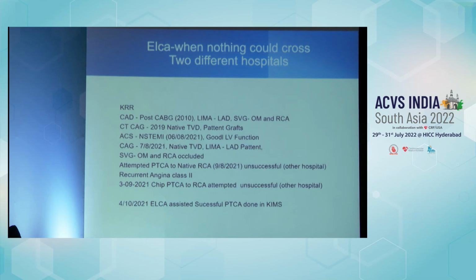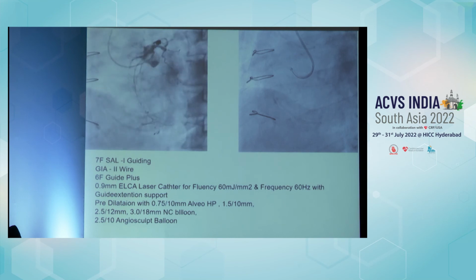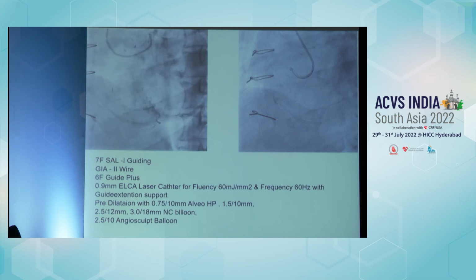The second time, the fluoro time was very high, and the procedure was abandoned. And then he came to our hospital, and this is his native coronary. So you can see the RCA filling retrogradely.